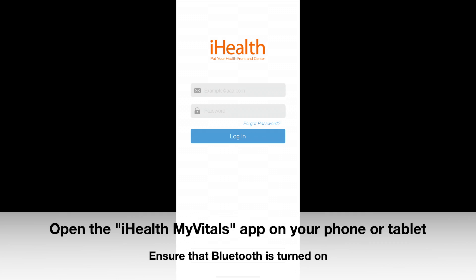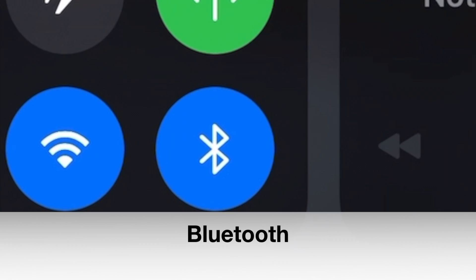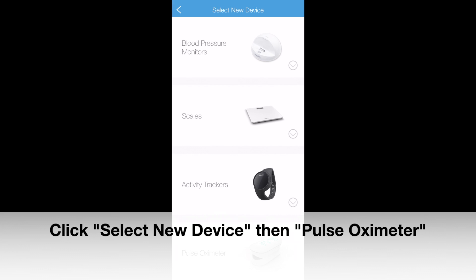After charging the device, from your smartphone or tablet, navigate to the iHealth My Vitals app. Ensure that Bluetooth is turned on. Then connect your device to the iHealth app — click Setup My Devices from the menu bar, select New Device, then click Pulse Oximeter.